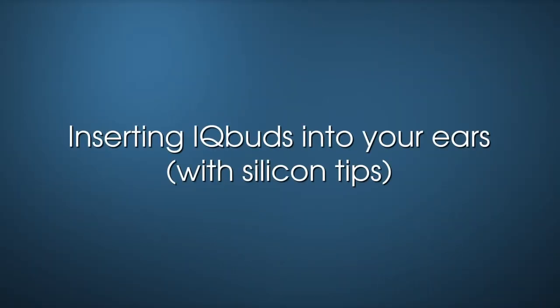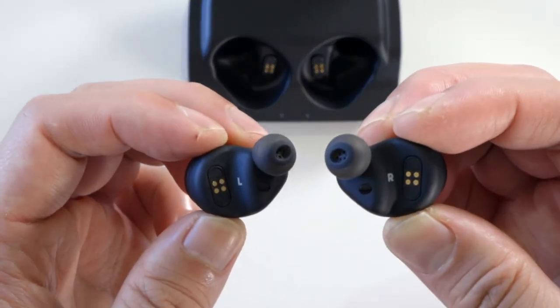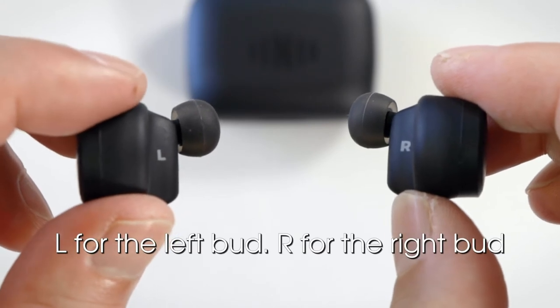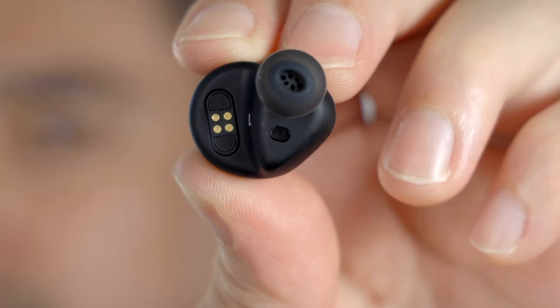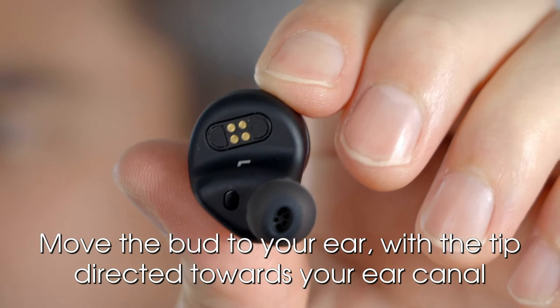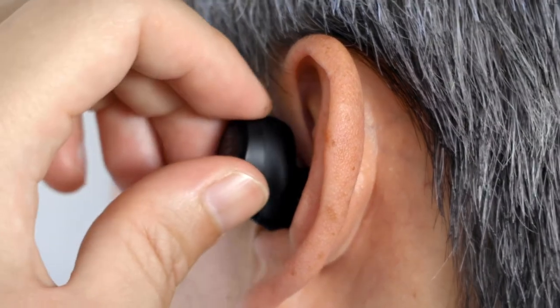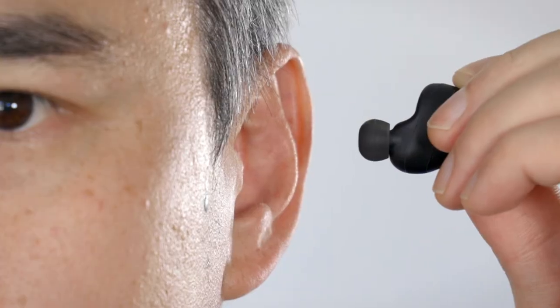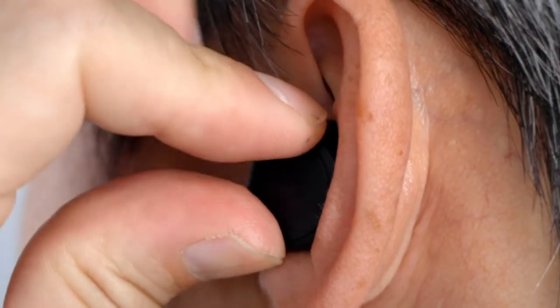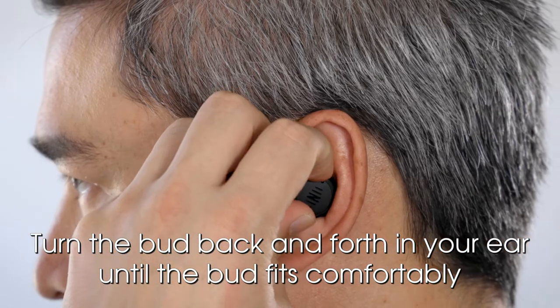Inserting IQbuds into your ears with silicon tips. First, ensure you are holding the correct bud in the correct hand. Look on the bottom of the buds for the indication: L for the left bud and R for the right bud. Hold the bud like so, gently gripping the edges of the bud with the tip at the bottom. Then move the bud to your ear with the tip directed towards your ear canal and insert the bud. When the bud is inserted, while applying gentle pressure, turn the bud back and forth until the bud fits comfortably in your ear, ensuring the best seal.